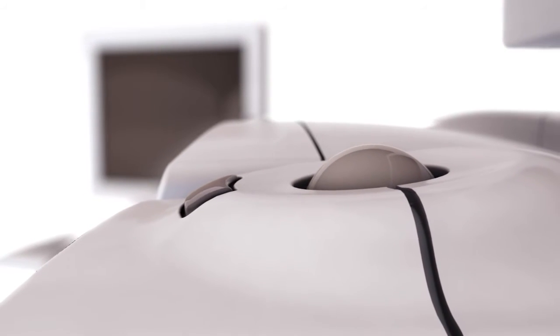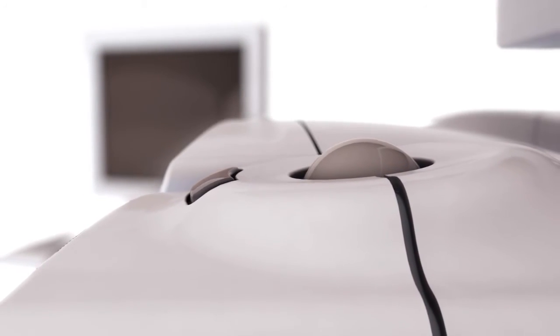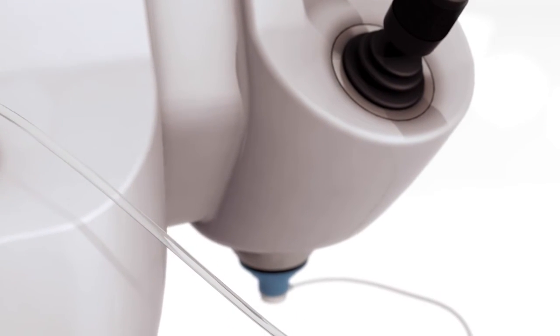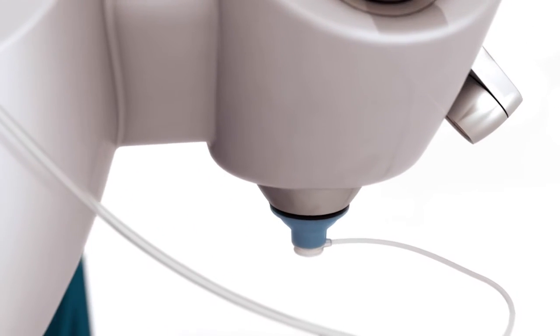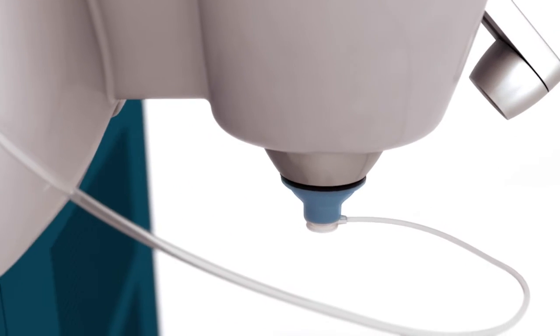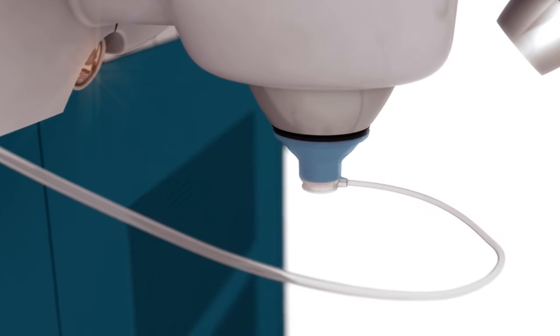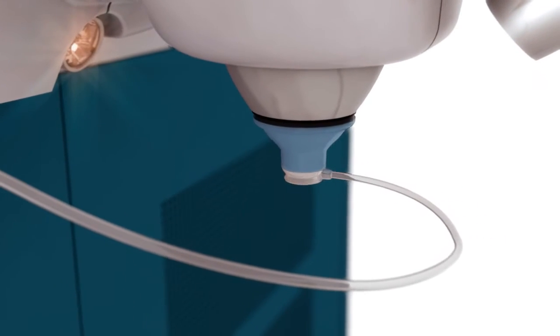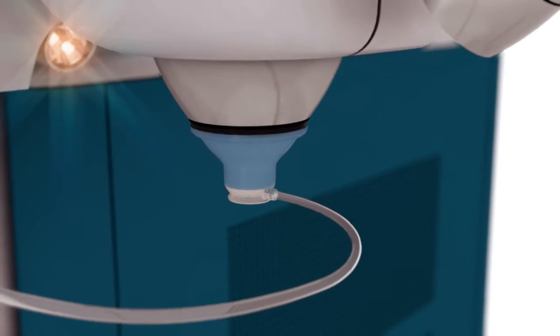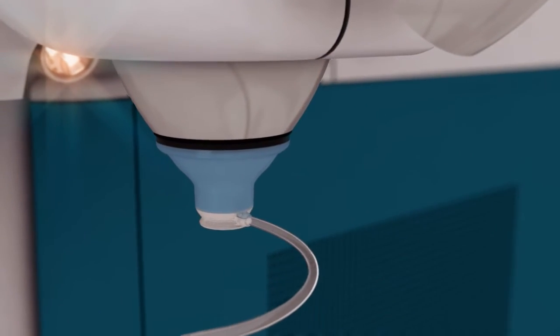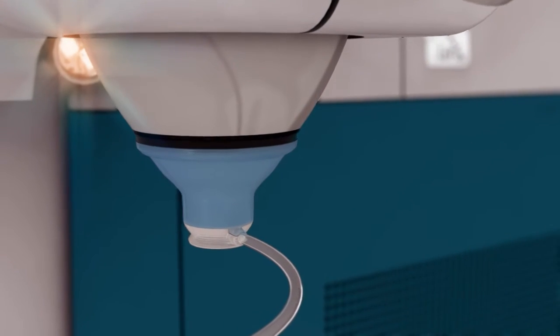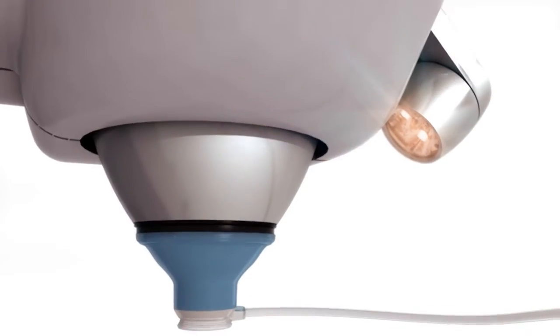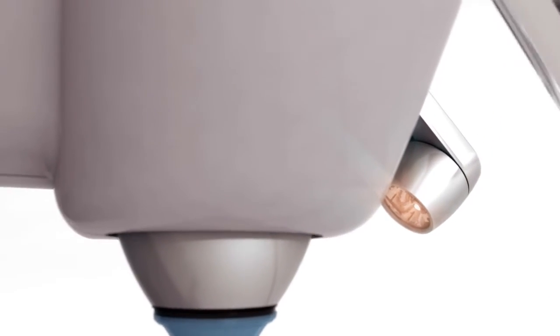Capsulotomy, lens fragmentation and all corneal incisions are created with image-guided surgeon control. The first femtosecond laser cleared for applications in cataract surgery, Alcon's LensX laser is an image-guided surgical breakthrough.